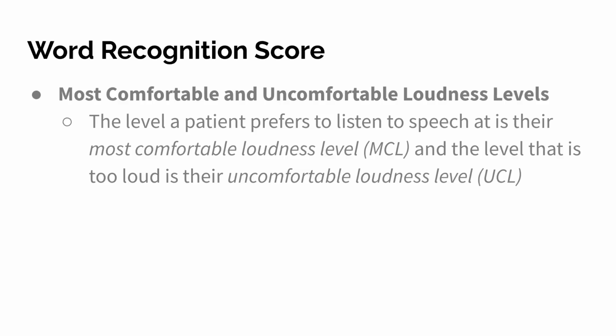The level a patient prefers to listen to speech at is their most comfortable loudness level, and the level that is too loud is their uncomfortable loudness level. Pretty straightforward. Typically, the most comfortable loudness level bisects the speech recognition threshold and the uncomfortable loudness level.